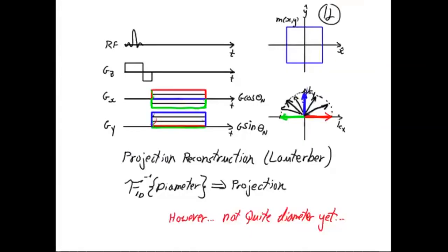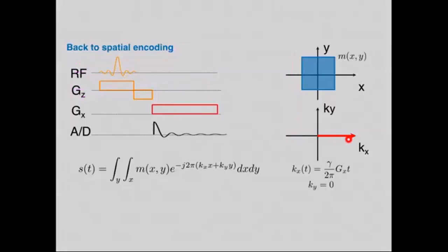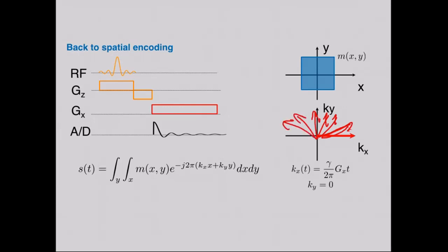the point here that I want to make is that the fact that I collected this one line, or at least half a line in a Fourier transform, is kind of like performing a projection. And if I were able to collect another line, and another line, and another line, all of these are also projections. So I can leverage the same mathematics as in CT to compute the volume from its projections. So I have enough information to do that. Okay, that's kind of the idea.